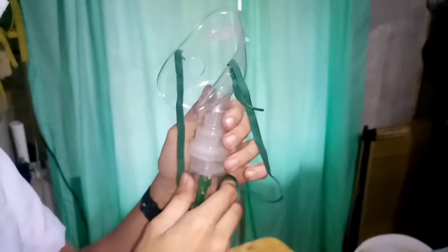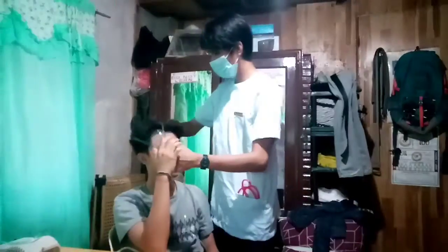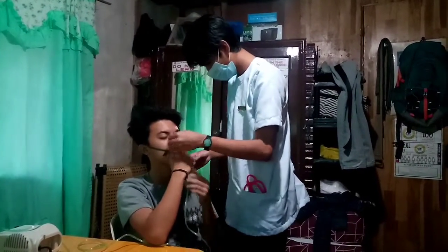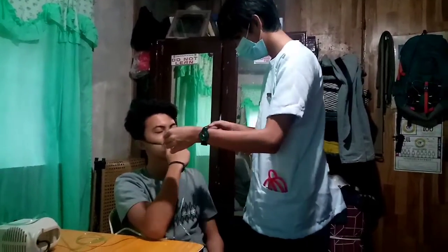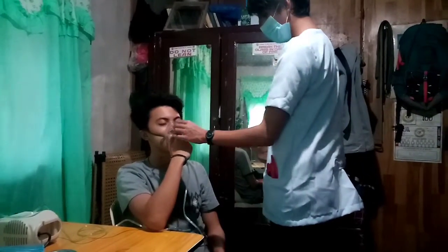Observe the fine spray from the nebulizer. Encourage the patient to breathe the nebulizer vapor through the mouthpiece. A mask may be used if a patient has difficulty with the mouthpiece.